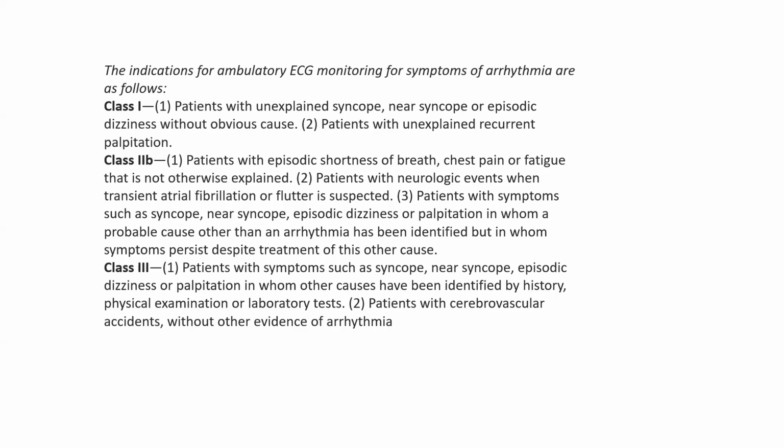And for patients with cerebrovascular disease, it is also not indicated where there is no evidence of arrhythmia.